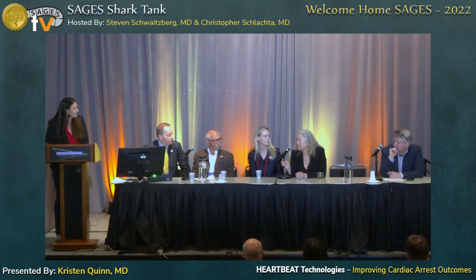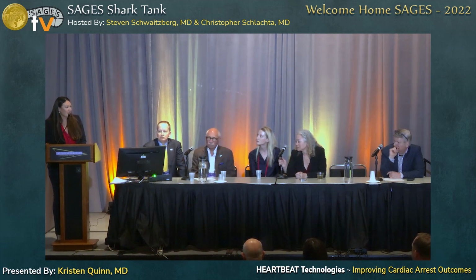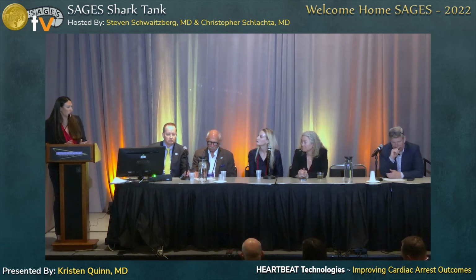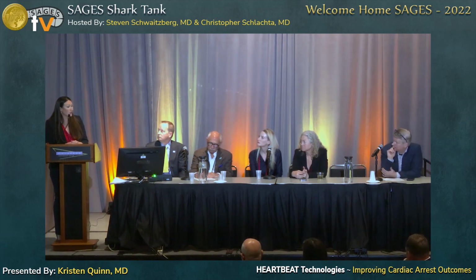Do you envision having different sizes in this device? Because patients are in a variety of different sizes as well. Yes, and that's something that's been really important to the design. We'd ideally like to have one that fits most initially, and then in the future be able to have 2 sizes that can cover the majority. Luckily, cardiac arrest is less common in the pediatric population, so we don't have to worry about making the super tiny sizes.